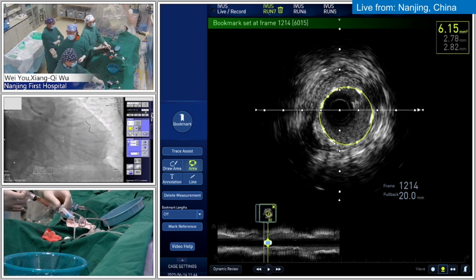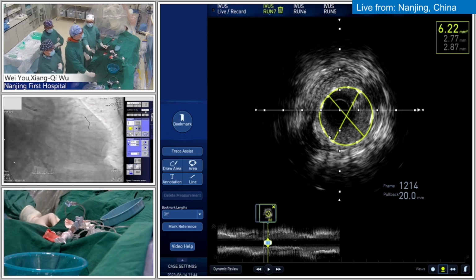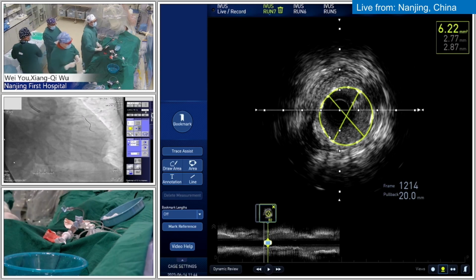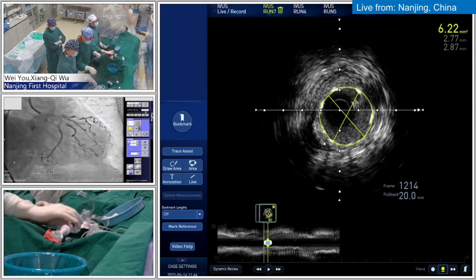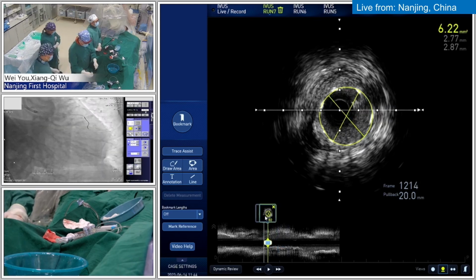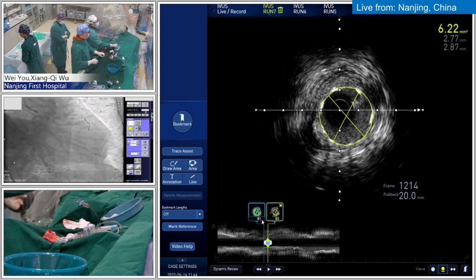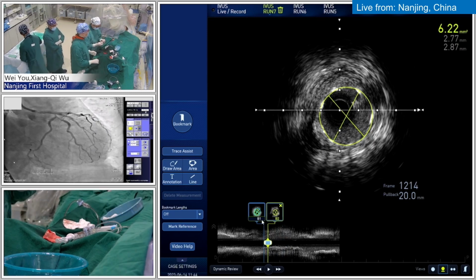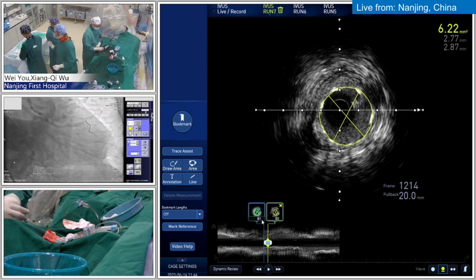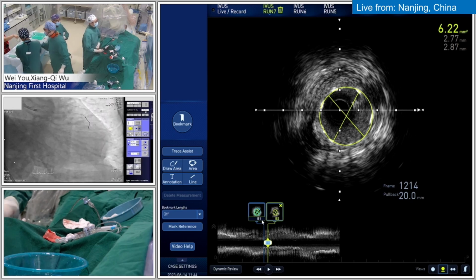What is the overall trend? Some new devices with it, and we conducted a similar exercise during, I think it was week 6 or 7, when we did an entire IVL day. There were 13 IVL cases from around the world. The intent is to use the MedStream platform to often pick up emerging technology, emerging product. We deliberately targeted IVL and demonstrated some exceptional use.